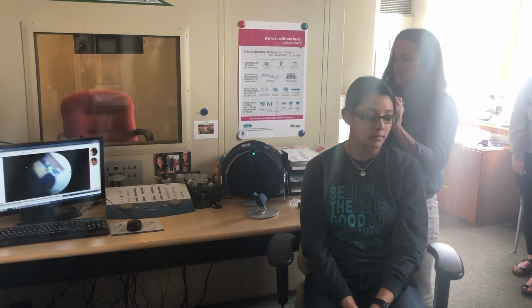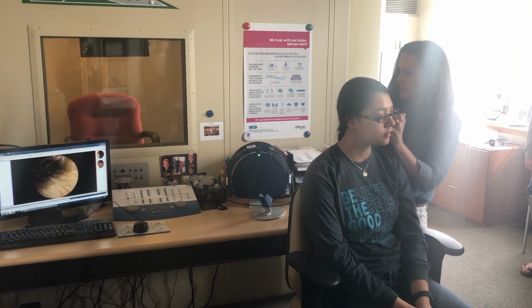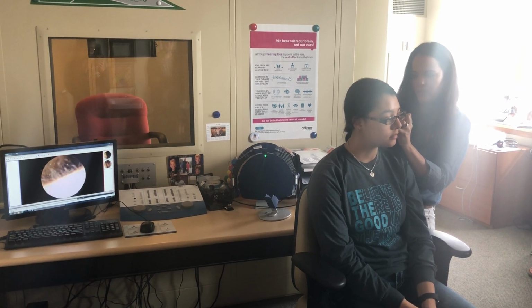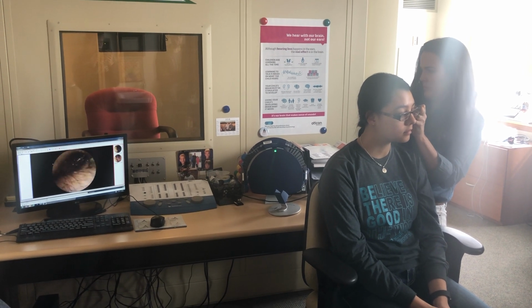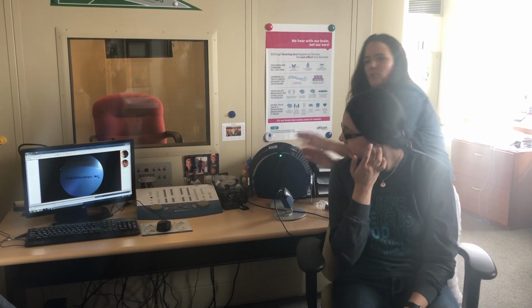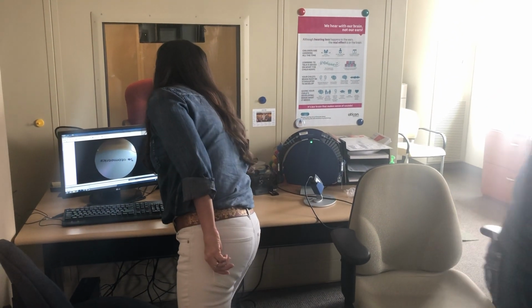Now I'm going to do the left ear. Remember to always, always bridge. And you have to kind of practice holding it because you have to hold it stable and then push the button. It takes a little bit to actually record. Okay, so you can practice with that. And then I'm going to leave this tip on there for whoever's testing her so that way you guys can use it. And now we'll go into the test booth just to show you what it's like on that end.